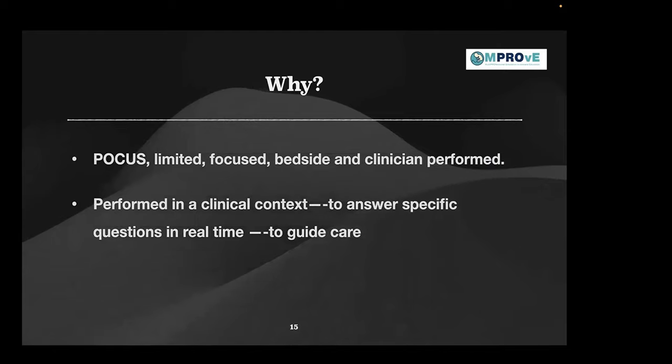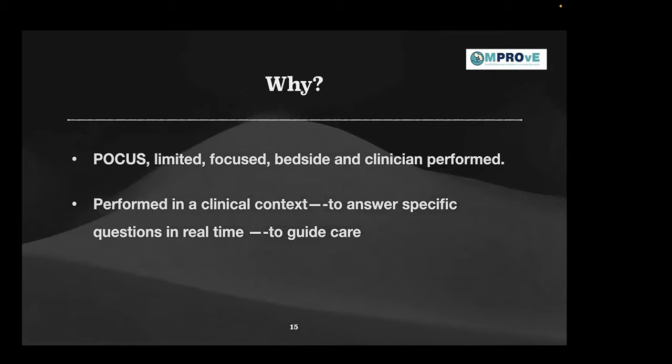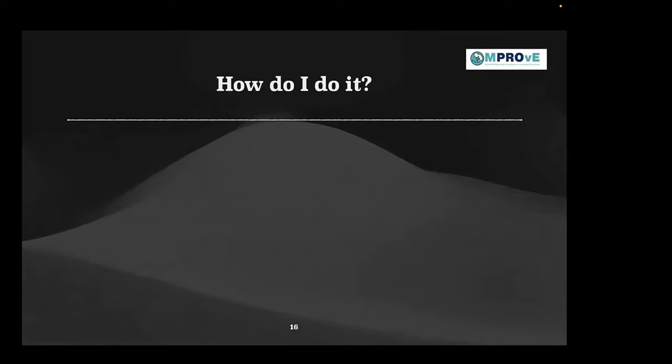A random scan without any clinical background will not be able to interpret much. We can say these signs are there or these artifacts are there, but it won't be answering you in terms of pathology, what kind of pathology we are dealing with. And the POCUS always guides care. So you can tailor your care depending on your scan result. Okay, so we know when to do it.